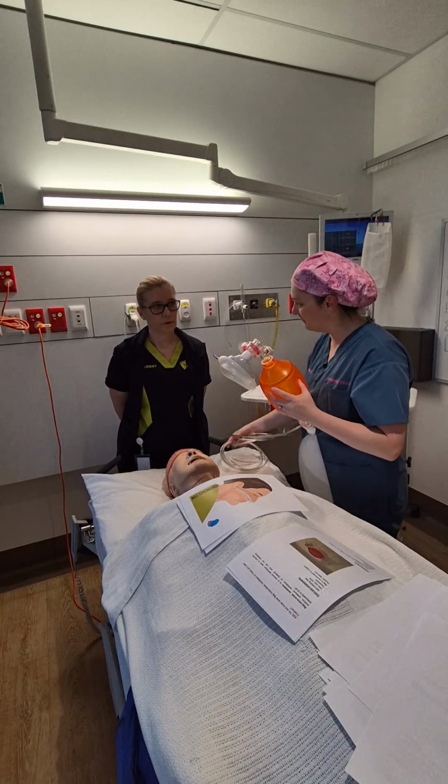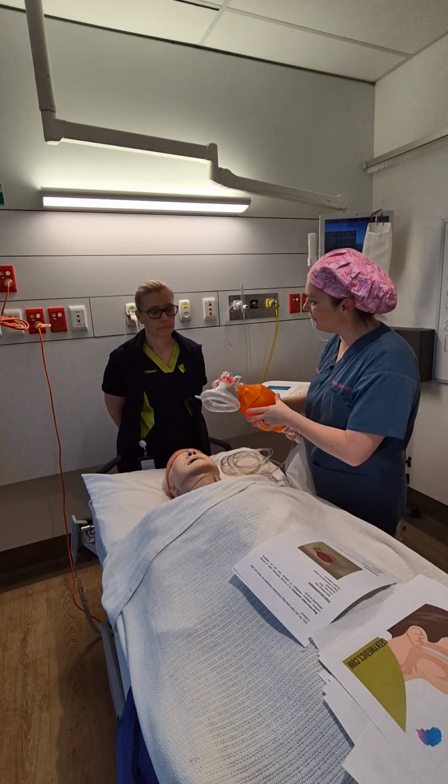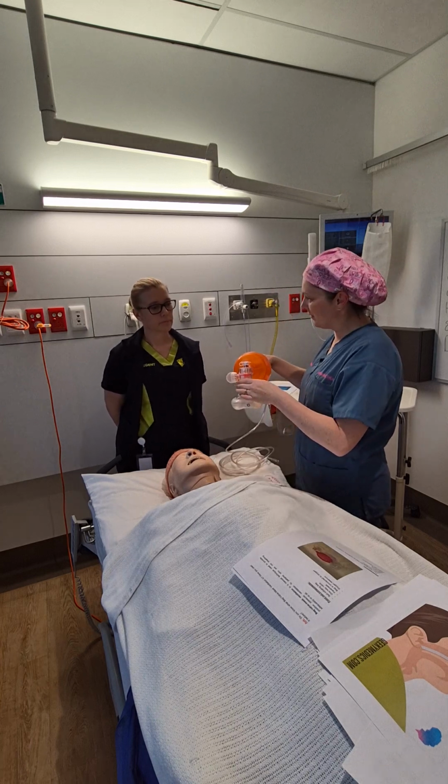Alright, have you ever done bag mask ventilation before, even in the simulation room? I don't think we have. Not really? No, not much of it. No. Alright, so you know what a bag mask valve is?